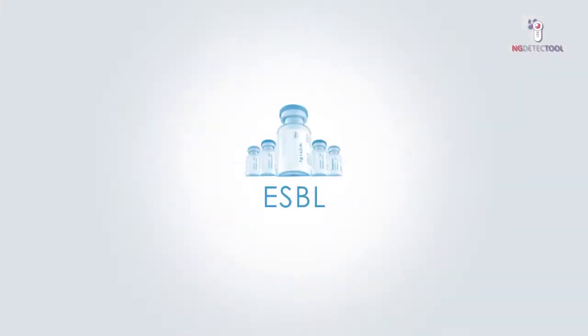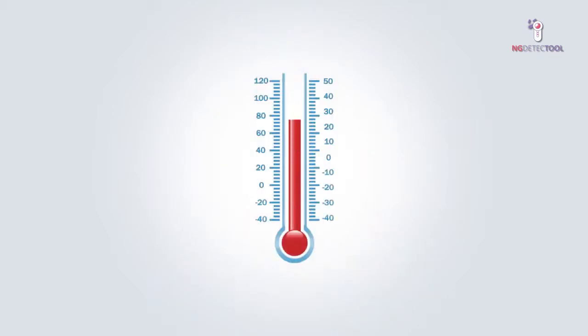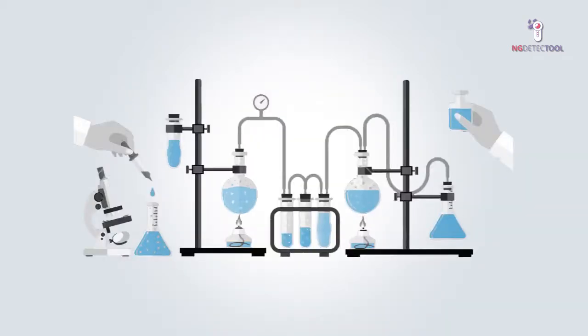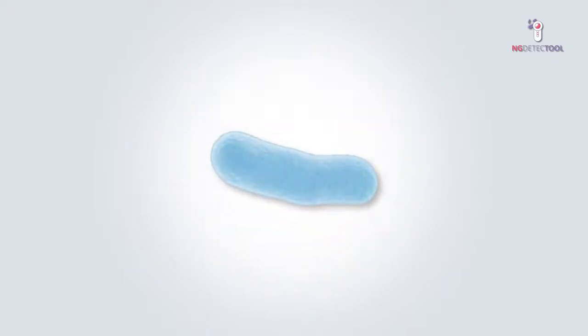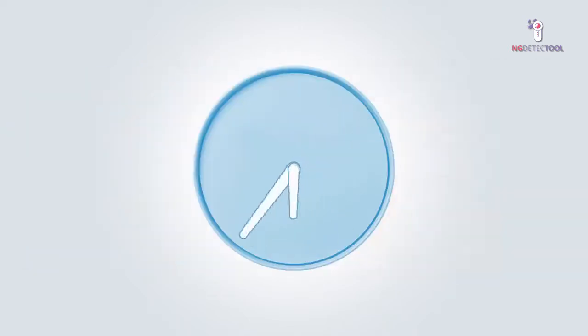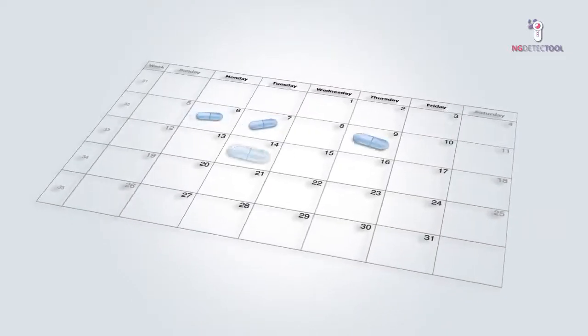Extended spectrum beta-lactamases, known as ESBL, and carbapenemases are of great concern, as an increase in the number of resistant Enterobacteriaceae causing infection is being detected. The current workflow for the detection of resistance in the microbiology laboratory requires isolation of the bacteria and the application of different methods, such as lateral flow immunoassays, biochemical tests, PCR or MALDI-TOF. These techniques take between 16 and 30 hours, meaning that the appropriate antibiotic treatment is delayed.